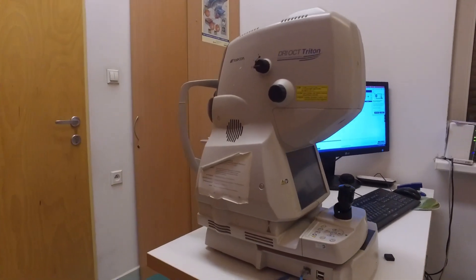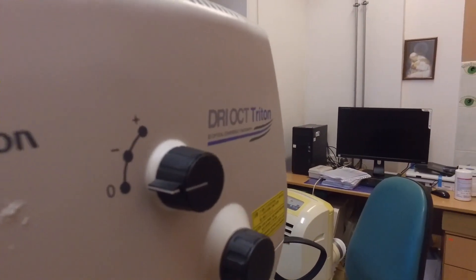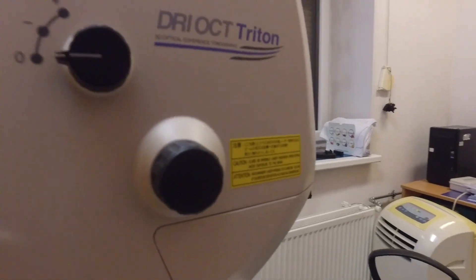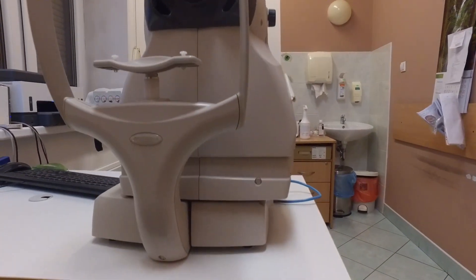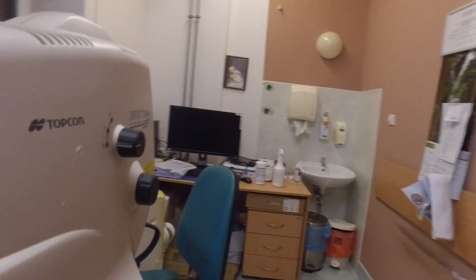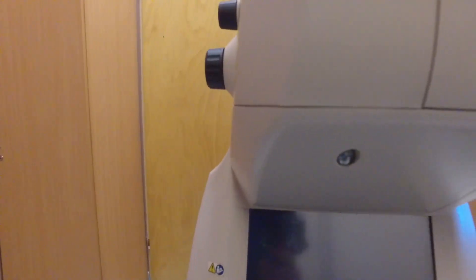This is the OCT Triton. There is a separate OCT and computer. On the outside we have two knobs: the first is the refractive error compensator, and there is also a focus knob which is on both sides of the machine. There's an external fixator, chin rest, and front rest. The machine is operated using a joystick.